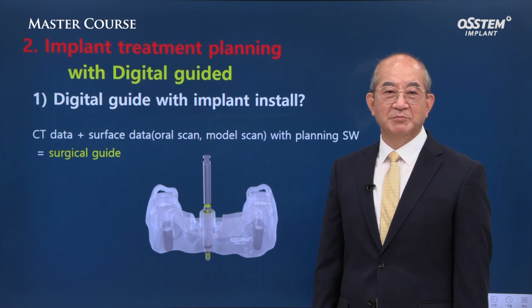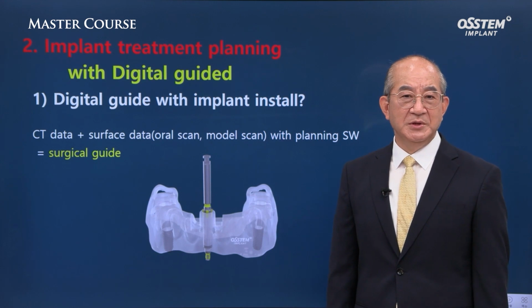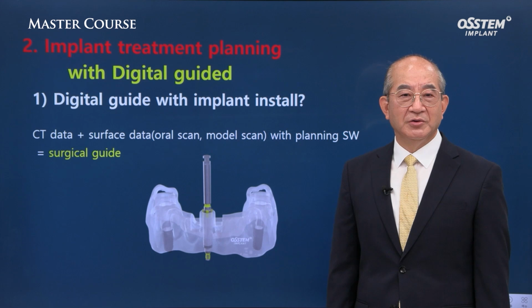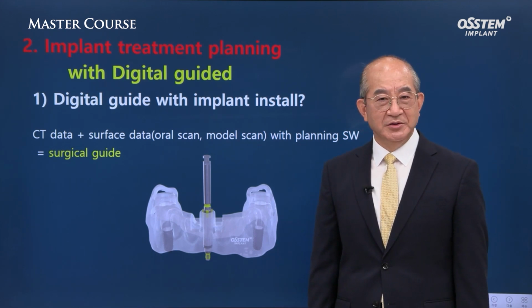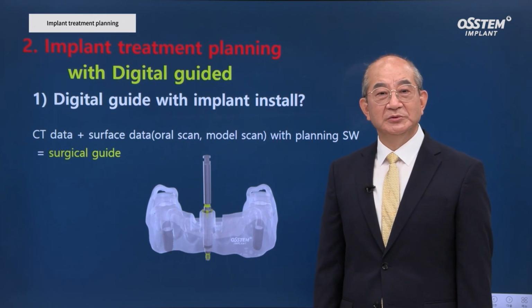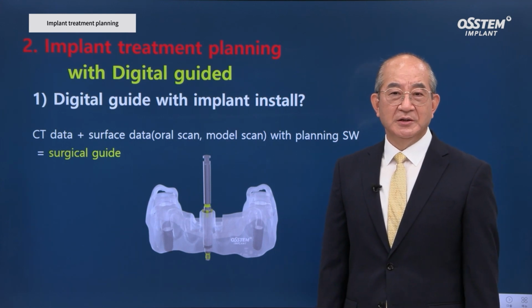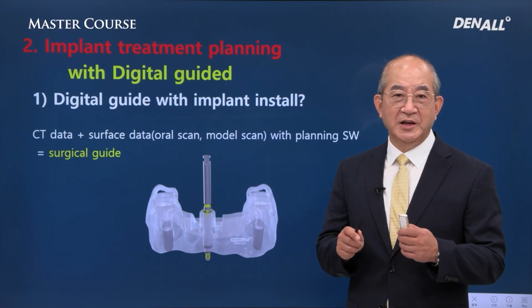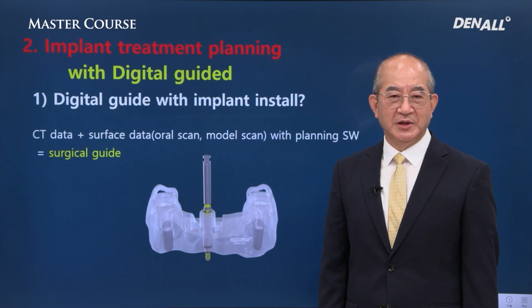In order to have this equipment, basically you needed to have film. You also needed to have developer and fixatives for the film. You needed to have these components in place to take X-ray images for implant treatment. These components are what your staff would worry about when they came into the dental clinic Monday morning. They would have to frequently replace the fixatives or developers.